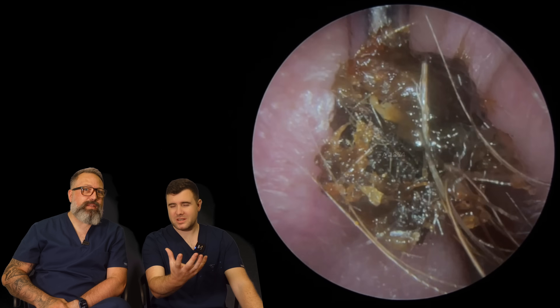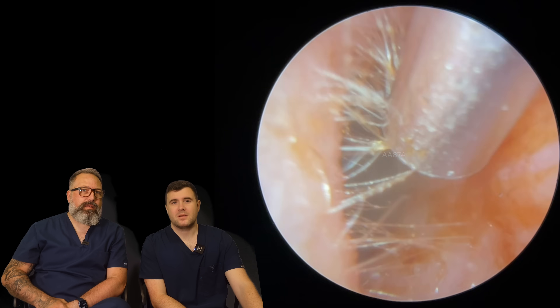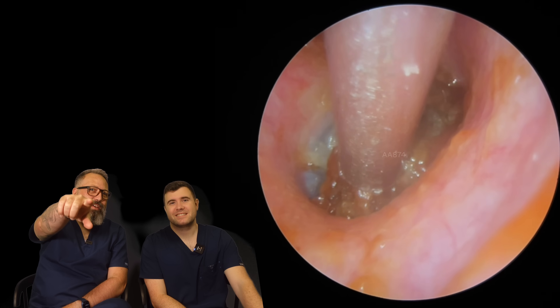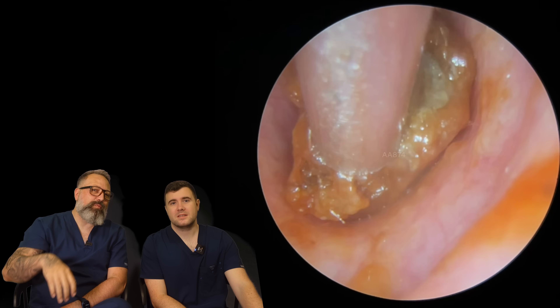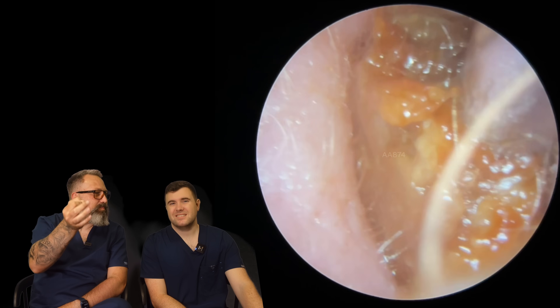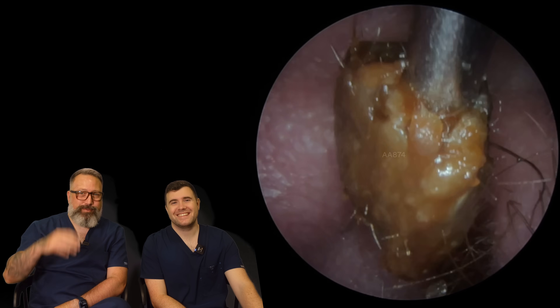It's when it's really thick and sticky and wet that you think, oh. This is always the worst bit here in that kind of stuck-down recess, because you want it to come away cleanly. That's not too bad actually — that's quite nice. It's when you start to take it away and get little tiny bits breaking off the top, that's when it's really awkward. No, you got quite lucky there I think. I think I did. Yeah, touch wood.